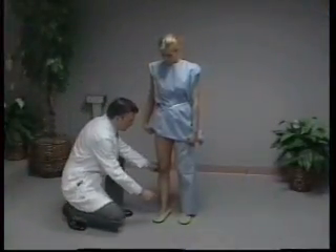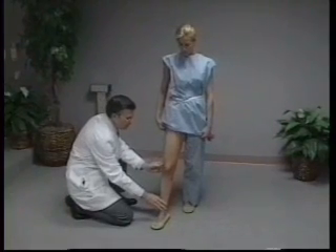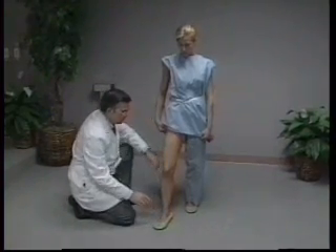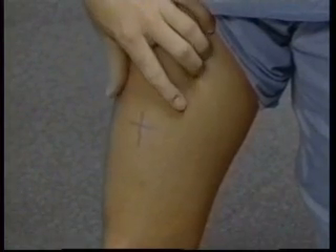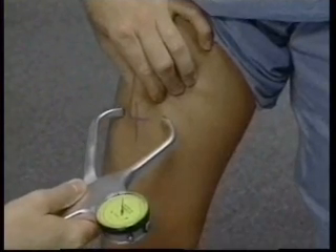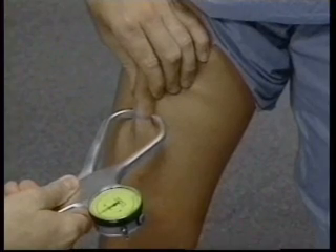The thigh skin fold is measured on the right thigh at the point previously marked for the thigh circumference. Following the same procedure used in positioning the subject for thigh circumference, the subject stands with most of the weight on the left leg, with the right leg forward, knees slightly flexed and the soles of both feet flat on the floor. The skin fold is taken up in the midline of the thigh, with the measuring technician's fingers centered just above the mark. The tips of the caliper jaws are placed perpendicular to the length of the fold, two centimeters from the fingertips, and centered over the marked point.